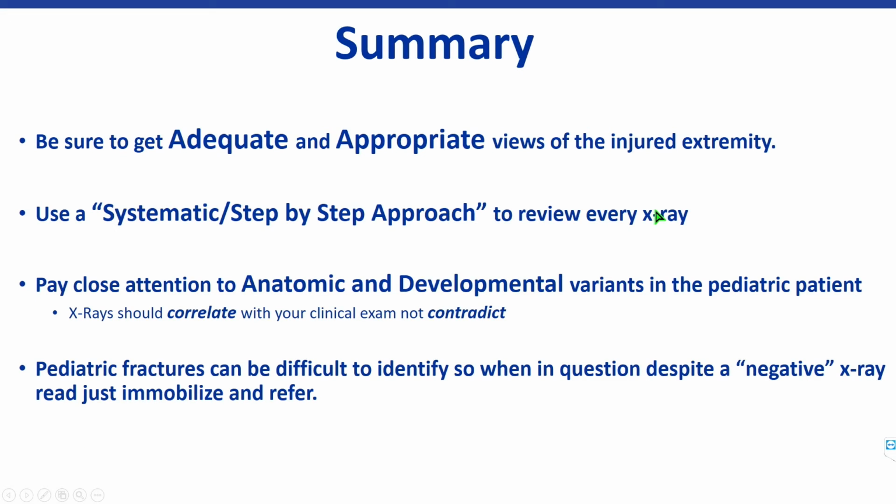So in summary, be sure to get adequate and appropriate views of the injured extremity. It's extremely important that you work with your team and make sure you're taking good views. It helps you not only as the clinician to come up with the proper diagnosis and the correct treatment, but it also is helpful for the patient, because at their next stop, they may not have to repeat those images, further costing them money and radiation exposure.